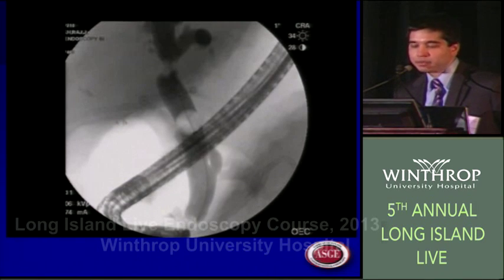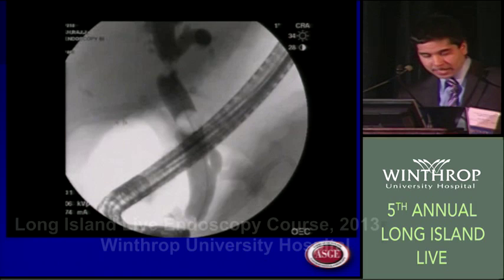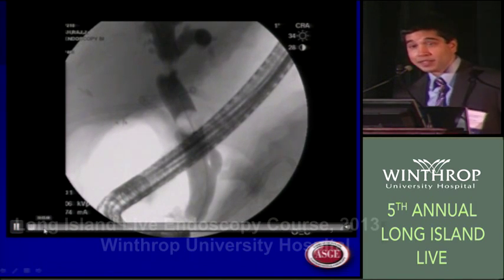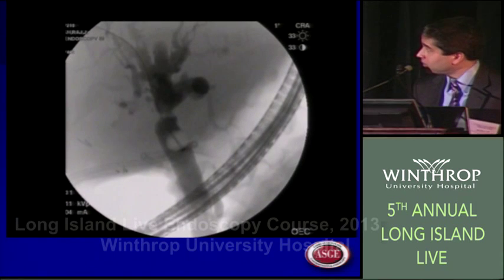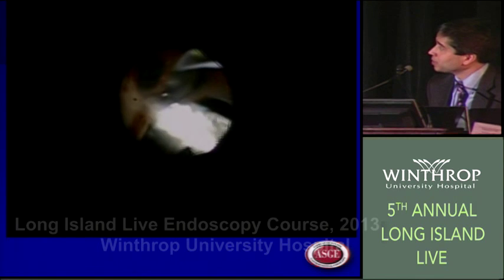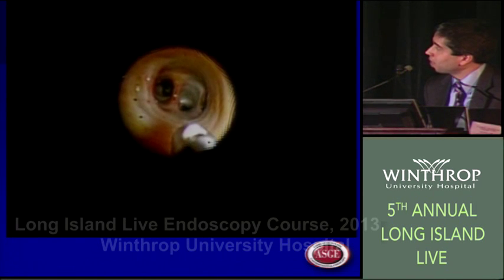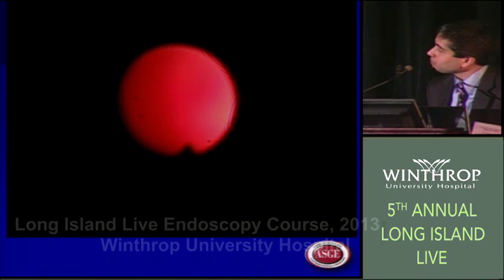So this is an example, a patient who actually had 5 prior ERCPs at an outside institution, and actually had not only 5, but 3 previous cholangioscopies, SpyGlass cholangioscopies. And you see this filling defect in the common hepatic duct. Stricture, could that be a post-chole stricture? Could it be malignancy? And this is actually normal intrahepatics. And this is actually the SpyBite forceps that's being advanced.